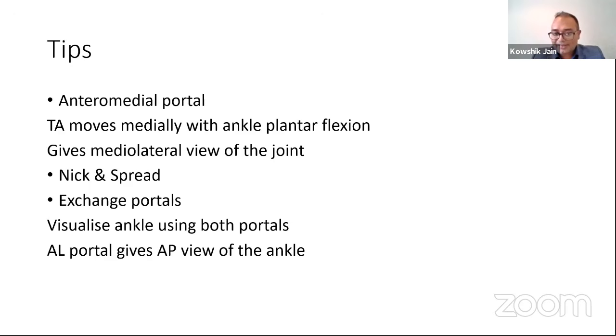I talked about the nick and spread technique. It's very, very important to stick to that technique to avoid damage to nerves, vessels, and tendons around the ankle joint. Always exchange portals. The number of times I have discovered something new when I've exchanged portals is just staggering. So every single time you do arthroscopy, exchange your scope from the anteromedial portal to the anterolateral portal. As I told you before, your anterolateral portal is the one which gives the AP view of the ankle. Anteromedial portal gives the mediolateral view.